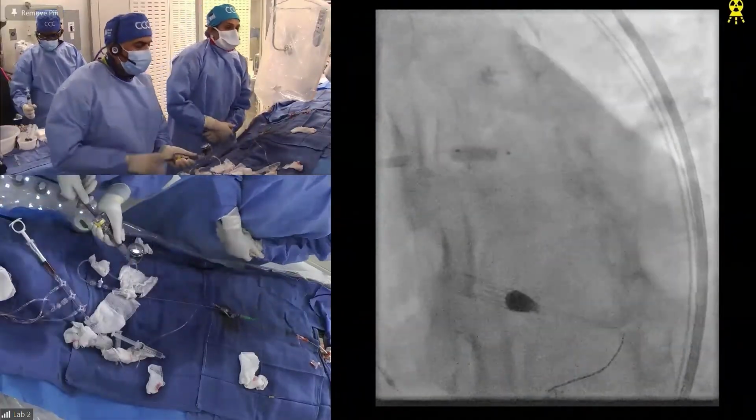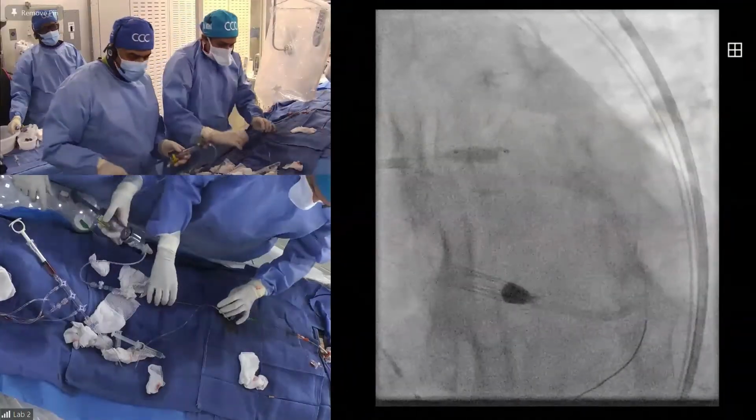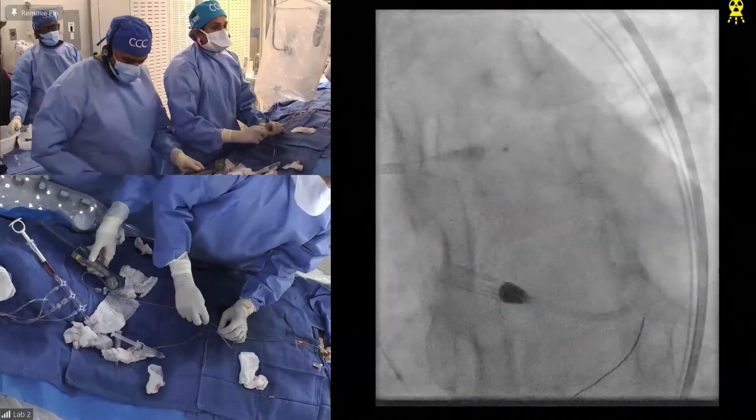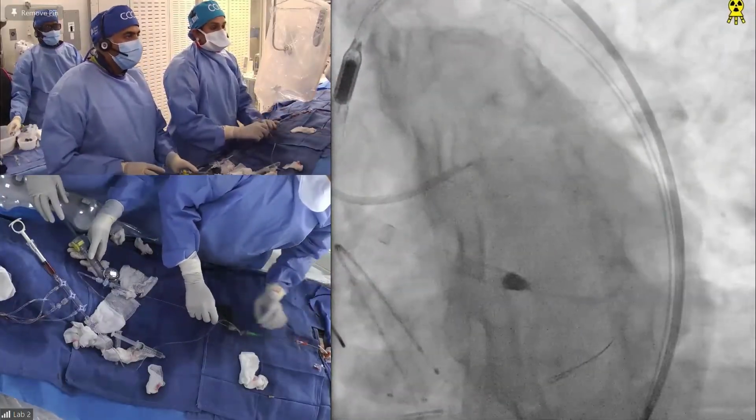Yeah, I think you can use this balloon and dilate more, a little bit down into that distal stent too. Overlap a little with it. Yes, I still think you have room in the proximal portion of that other stent. The proc circ, put in the LPL.